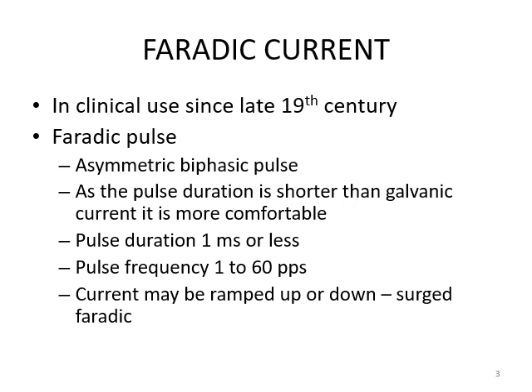The frequency of this current is 1 to 50 or 60 pulses per second, and each subsequent pulse intensity may be progressively increasing or decreasing, and the process of this ramping up and down intensity is known as surging of the current, and that's why many times such stimulators are known as surge Faradic stimulators.